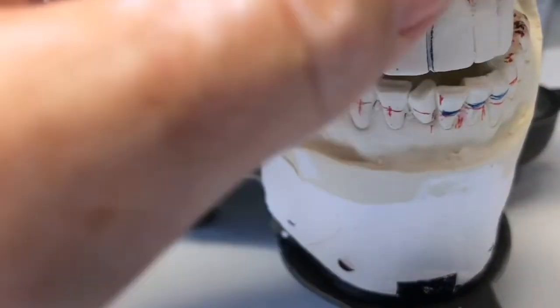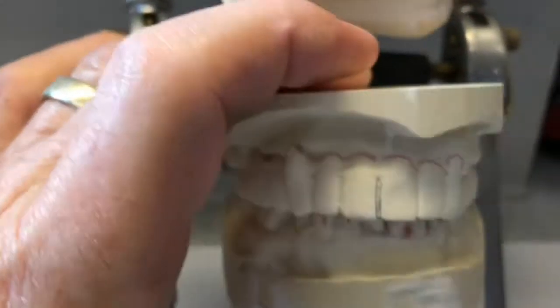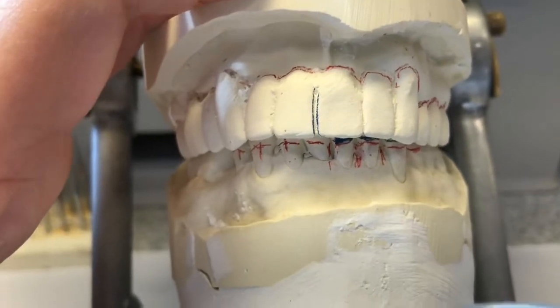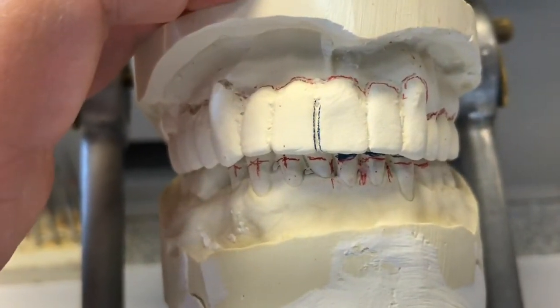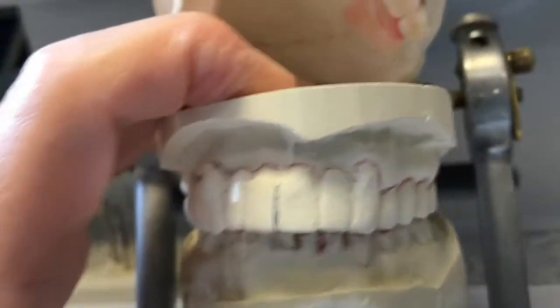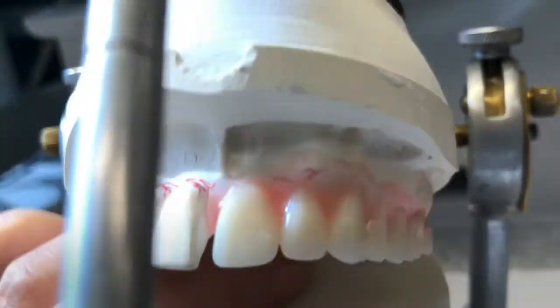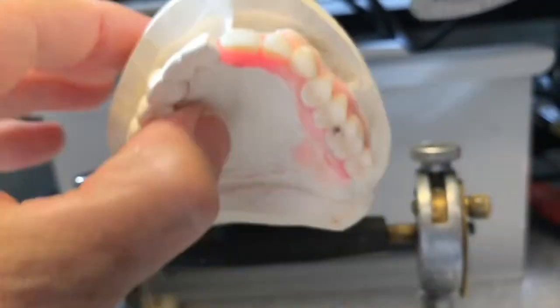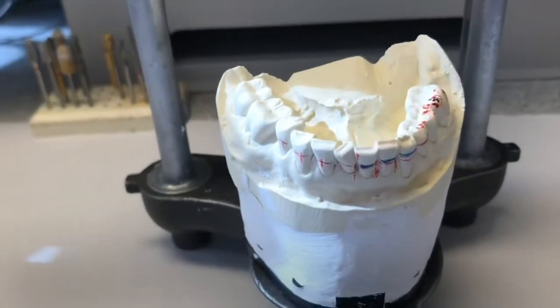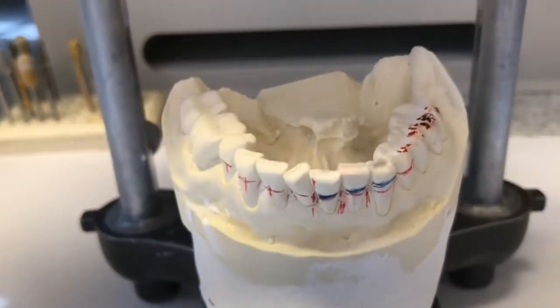Because the patient has all their teeth, we can see where the midline is off, but we can't try anything in. Our mounting is accurate because they've still got all their teeth. What we're going to do is surgerize the cast a little at a time and place denture teeth where the natural teeth were, with the exception of making some corrections.